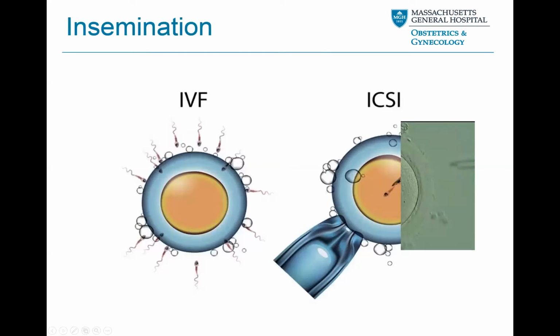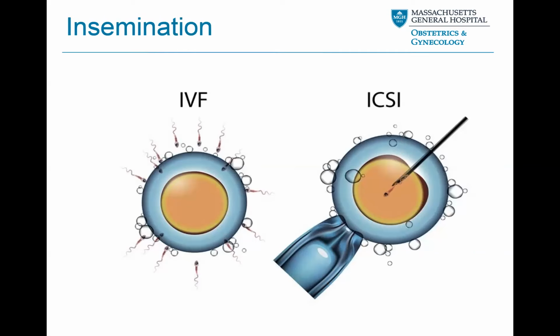And how do I choose the sperm that we're using for ICSI? Another great question. So there's different things that we're looking at in the sperm when we're trying to select which one we feel is the best to capture and put inside the oocyte. So what we're looking for are the ones that are forward progressing. We want them swimming in a straight line if possible, because if we are thinking about how everything would work with Mother Nature, that's the sperm that would win that race, right? It's not going to be the sperm that's just twitching side to side. It's not going to be that sperm that's swimming in circles. It's going to be that sperm that's swimming in that straightforward progressive manner.